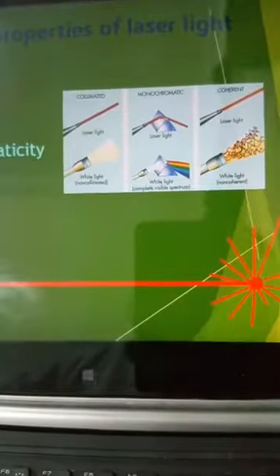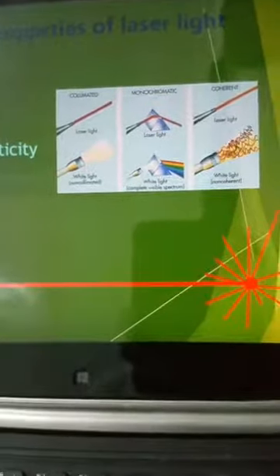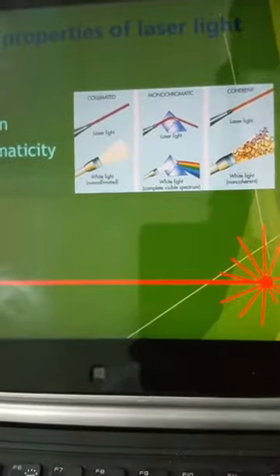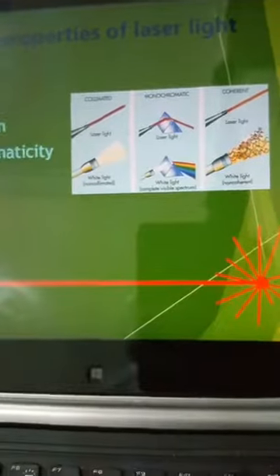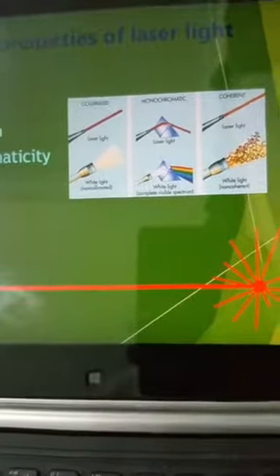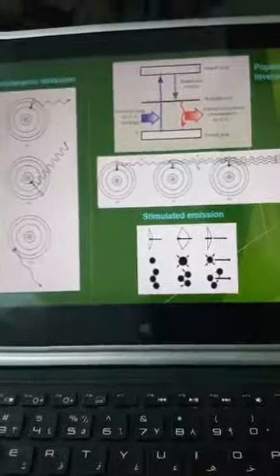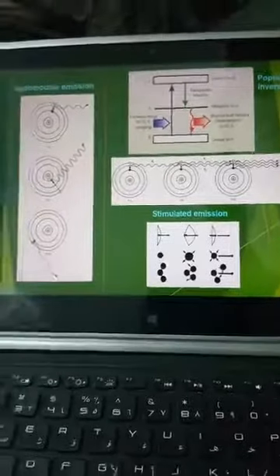The modern machines, they can combine two machines together, but they have two different sources. So two machines can come in together, but the sources are different. We call it blended wavelength. I will go into details, sorry for the focusing. I'm holding the mobile with my hand.